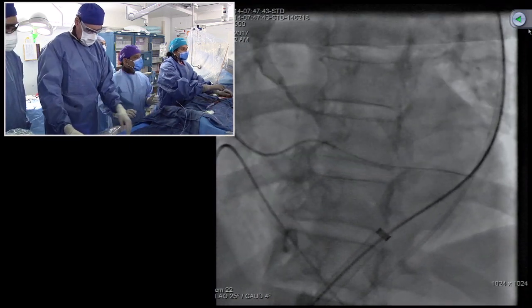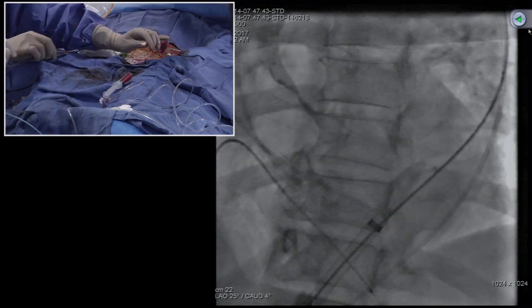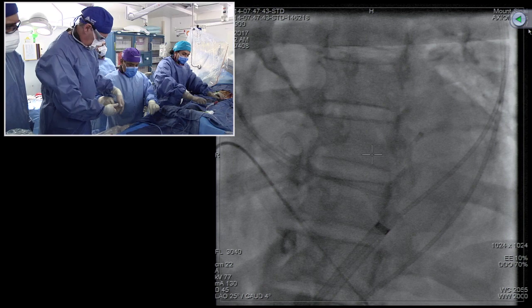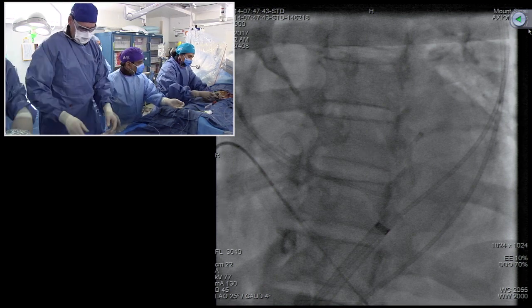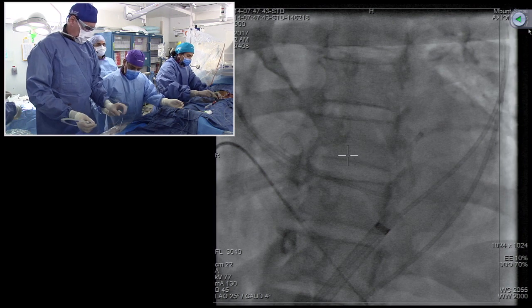Now, in this patient also, what happened is she has a rise in the creatinine compared to the last couple of weeks. Today, the creatinine is 1.7. So that's the reason, since the CT scan already had excluded her, we did not do an arch aortogram to make any more decision about Sentinel.